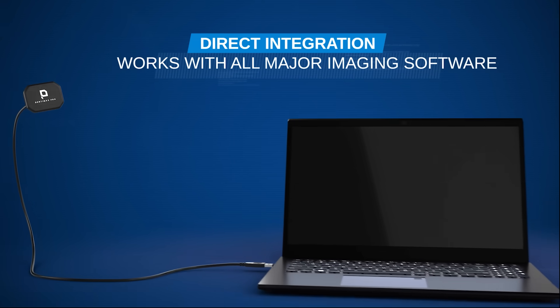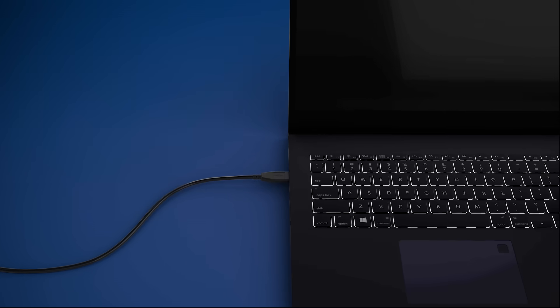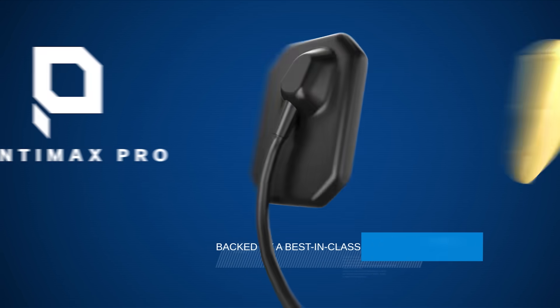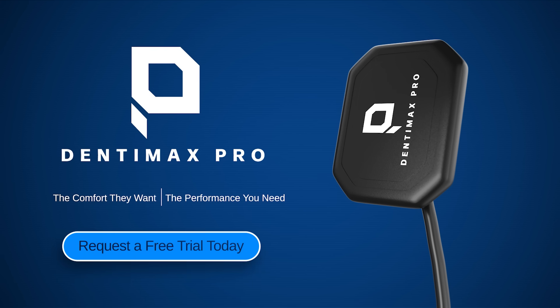Plug-and-play connectivity ensures seamless integration with all major imaging software. Your investment is protected by a best-in-class 3-year manufacturer warranty. Dentimax Pro — the comfort your patients deserve and the diagnostic clarity you demand. Request your free trial today.